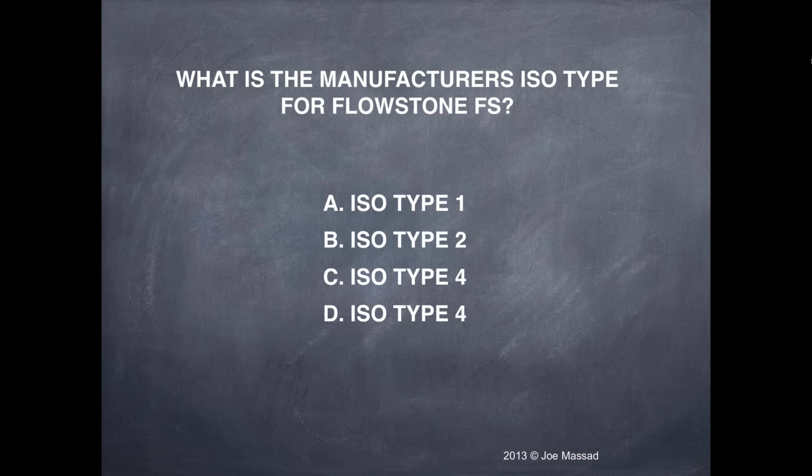We have one question, and it is, what alternatives have you used for the putty material? Play-Doh, alginate, or other materials? Well, of the three that I initially showed here, I have used the silicone, but it's way too expensive and hard to extract.